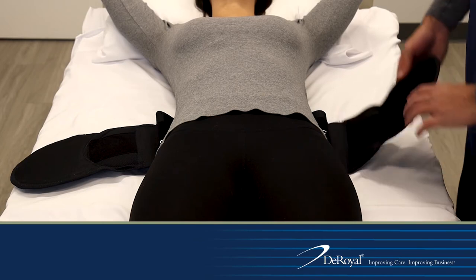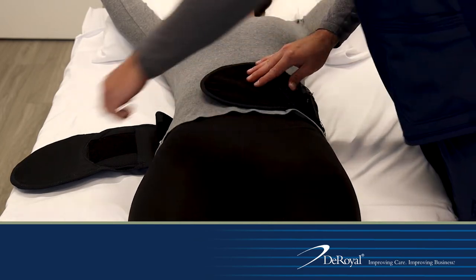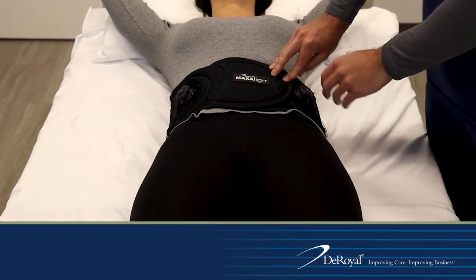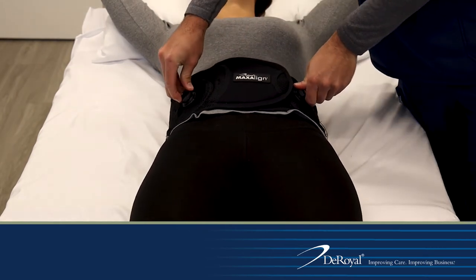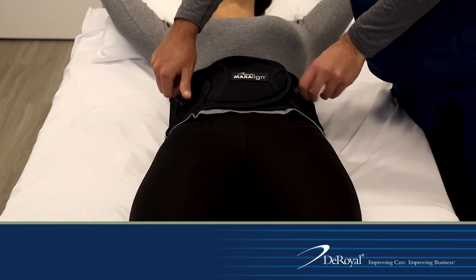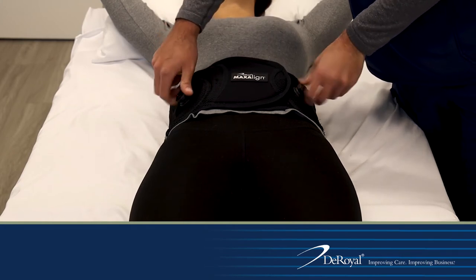Wrap the left side of the belt around the patient and place it just above the pubic bone. Close the belt by wrapping the right side around the patient and securing evenly to the loop section on the left side of the belt. Push in both BOA dials and turn clockwise evenly to provide compression.